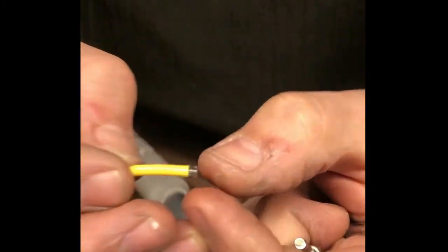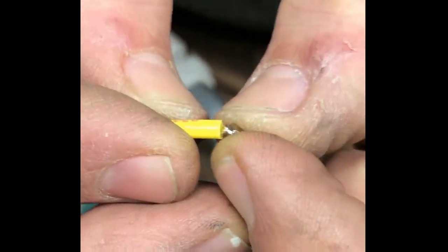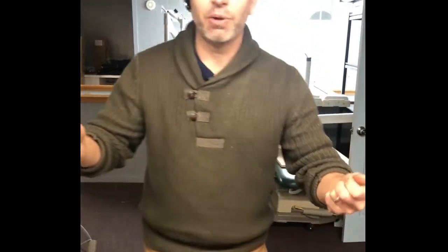Now watch when I pull it apart and you'll see exactly what happened, okay? I'm going to pull that apart and see that? Look at that. See, that just goes right over that. And it's tiny, and I think I just lost it forever. But guys, that was amazing.